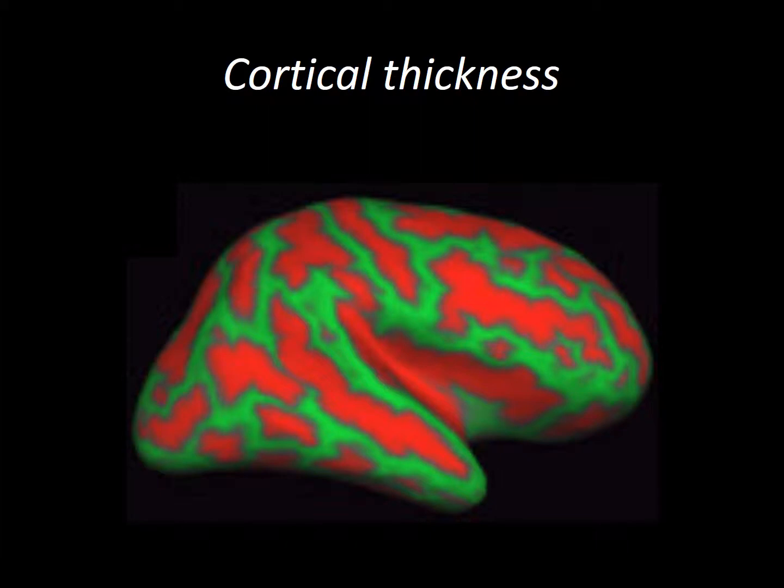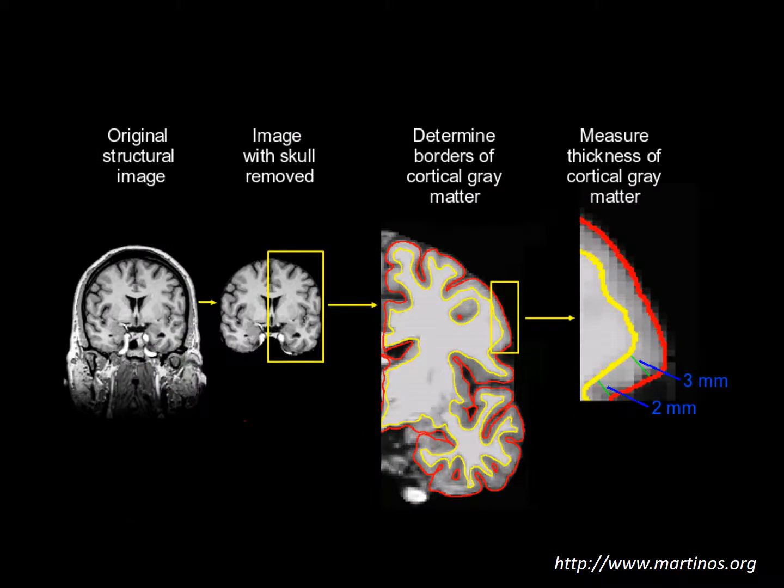Now, another variation on voxel-based morphometry type analyses is the use of a surface-based analysis, which essentially provides a measure of regional cortical thickness. Like voxel-based morphometry, surface-based analysis uses T1-weighted anatomical images to explore regional cortical thickness. The first process in surface-based analysis is to extract the cortex by defining the inner and outer margins of grey matter. This process is similar to that performed for voxel-based morphometry, in that the grey matter and white matter are defined in each individual subject.